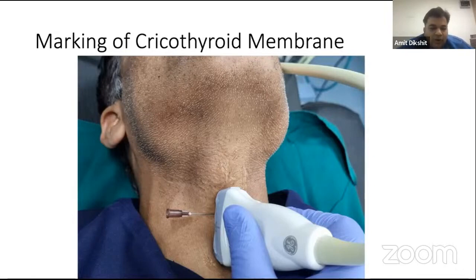So this is one school of thought, and this has been promoted, advocated, and popularized by Dr. Pankaj Kundra and team. For critically ill or high-risk patients, we do put a radial artery cannula, and at the end of surgery, we just remove that cannula and the patients are safe. So in a difficult airway, why not not only mark, but go one step ahead and just puncture it and place the cannula? In an emergency, whenever there is trauma, it is very difficult to get any cannula. And it can be a marker if somebody needs surgical tracheostomy, it can help the ENT surgeon also, because sometimes the neck is too difficult, a big thyroid, a fixed mass, a static neck, patient in stridor in sitting position, we hardly get one best chance to perform. So this is one school of thought.